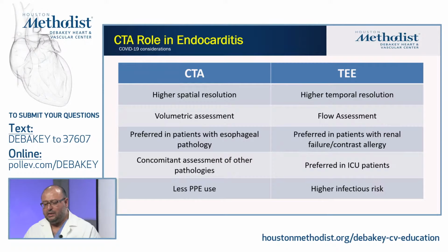TEE obviously has the best temporal resolution in these patients, and flow assessment is by all means much better with TEE. And patients with renal dysfunction and contrast allergies are much better served by TEE, because you need contrast for these CTs to have a good assessment of the aorta and its complications.